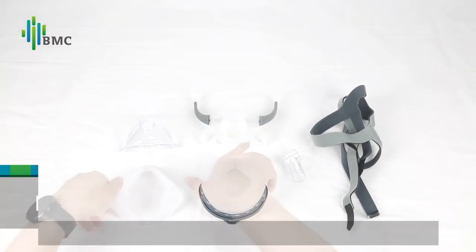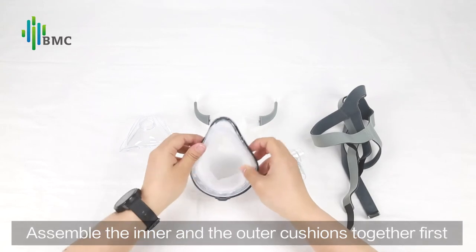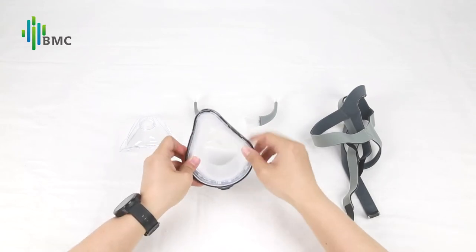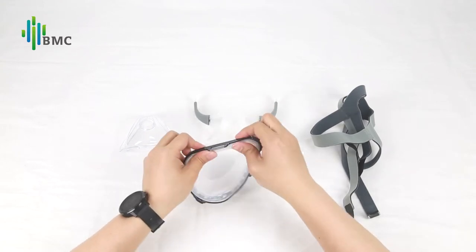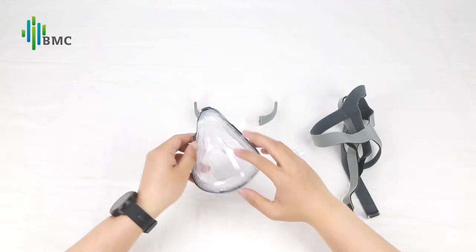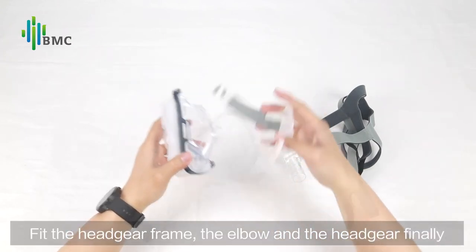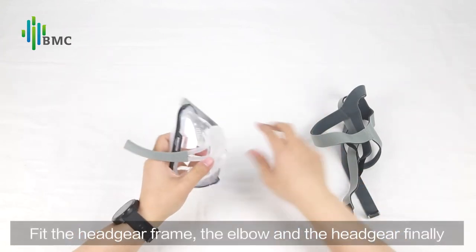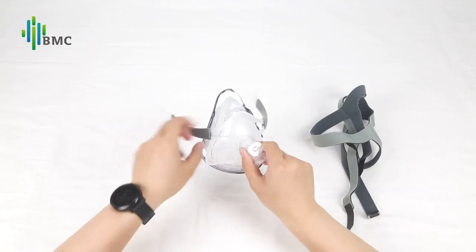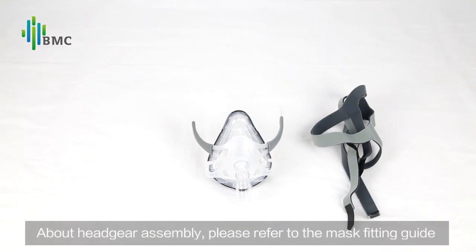Mask Reassembly: assemble the inner and outer cushions together first, then fit them into the mainframe. Fit the headgear frame, the elbow, and the headgear finally. For headgear assembly details, please refer to the mask fitting guide.